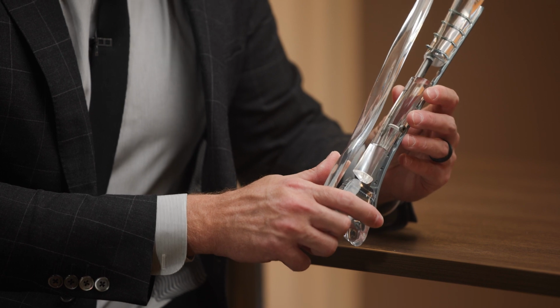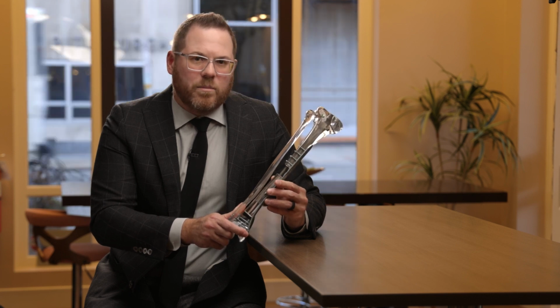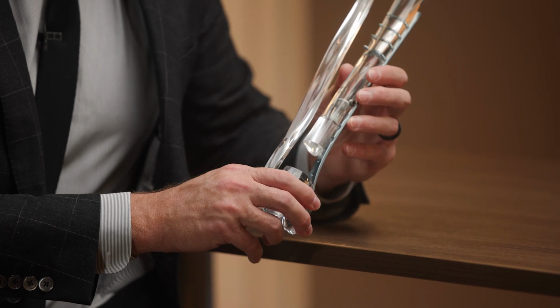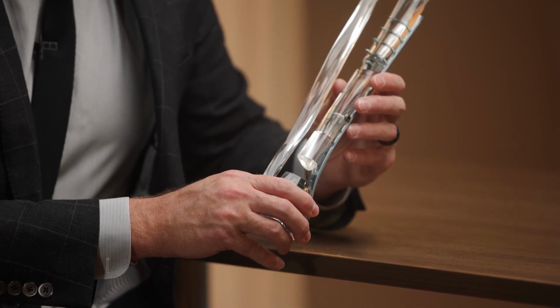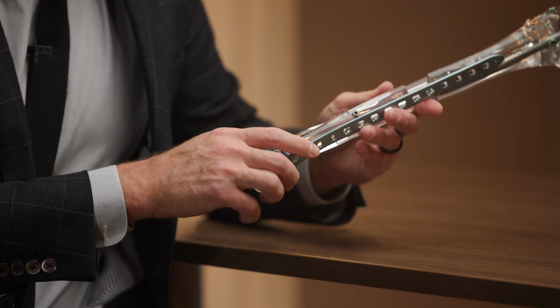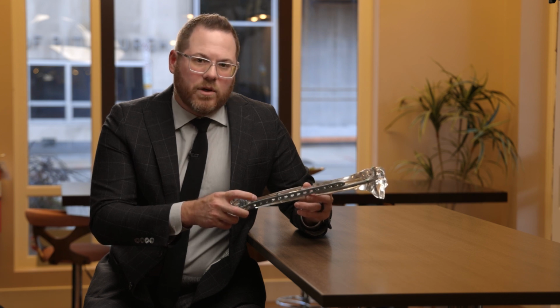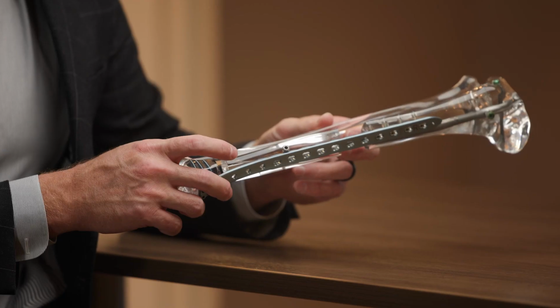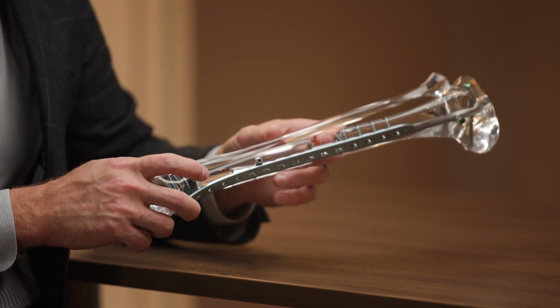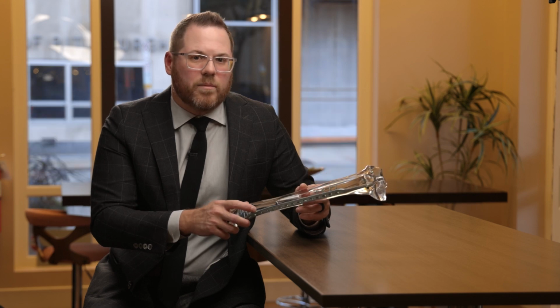The plate medially and the intact fibula laterally are essentially acting as train tracks in order to maintain position of the transport segment. When performing the PABST technique with an antegrade push technique, the plate medially and the fibula laterally keep the transport segment well aligned, typically in the coronal plane. What I've found in the sagittal plane is with transport, the segment can be off course either anteriorly or posteriorly. So as it approaches the docking site, there are techniques that I've utilized in order to maintain alignment of the transport segment with the distal segment.